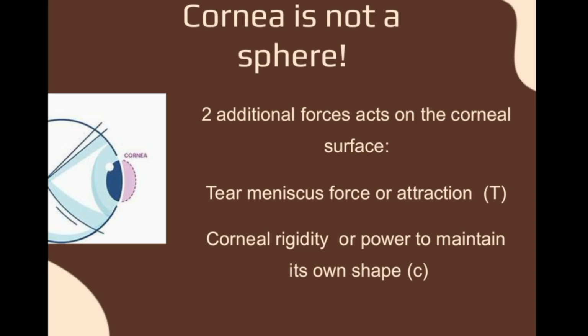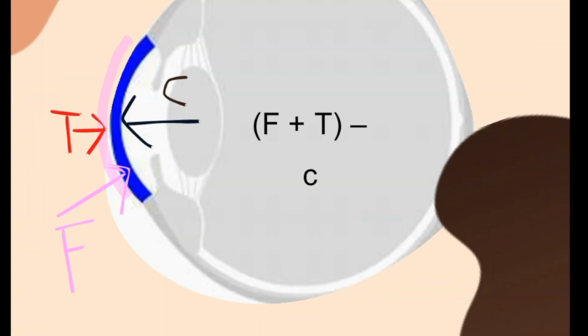Now this is a very important thing, we are going to discuss it here. As you all know, onto the surface of the cornea there is another layer, the tear film, which provides nutrition and helps the tears stay over it for reducing friction, and there are a lot of other purposes of the tear film. So we all know that there is an additional layer on the surface of the cornea. So when you are making the corneal surface plane, or when you are touching the Goldmann tonometer to this cornea, what is happening? It's not only the cornea, there is another additional layer over there.